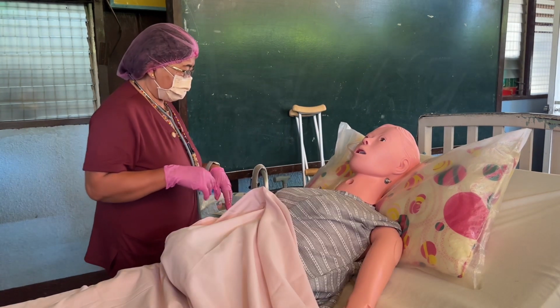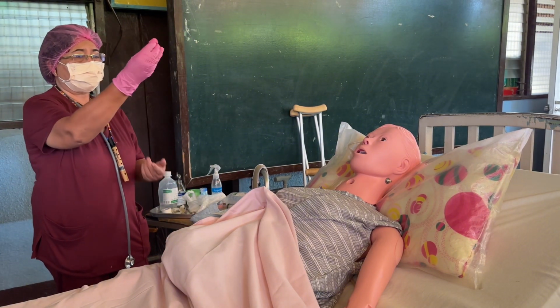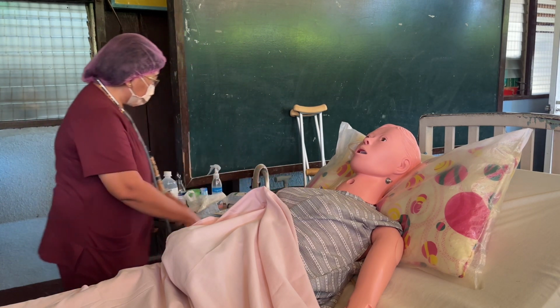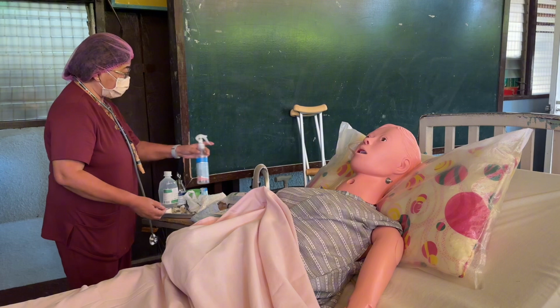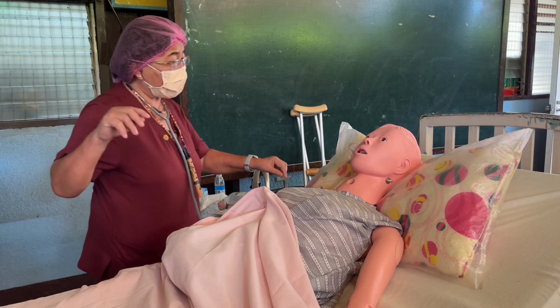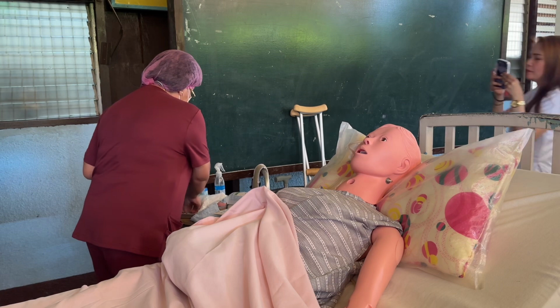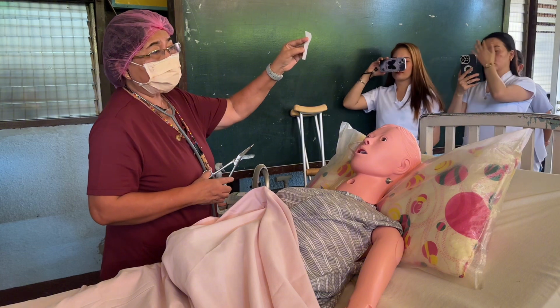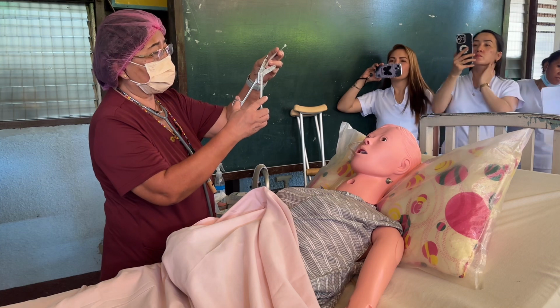Okay. Anchor the tube. So I'm going now to remove my gloves. Gloves to gloves. Okay, skin to skin. Then I'm going to do the hand washing technique. If the sink is quite far, I'm going to use hand sanitizer. Okay, air dry. Now I'm going to do the right anchoring of the tube. Okay, so this is the right width. So you have to split it into 2.